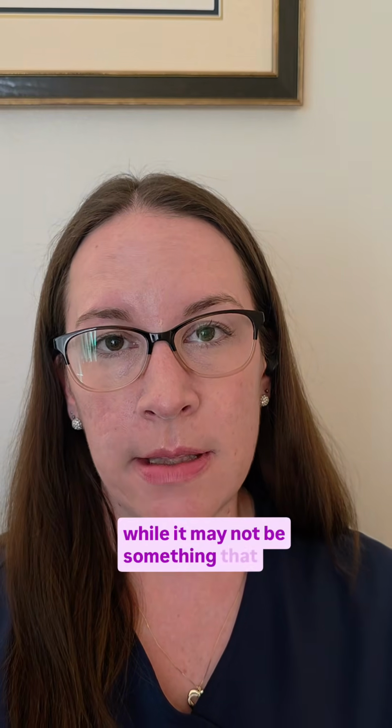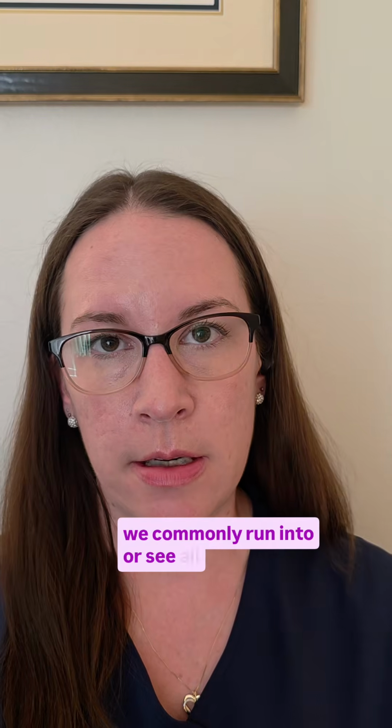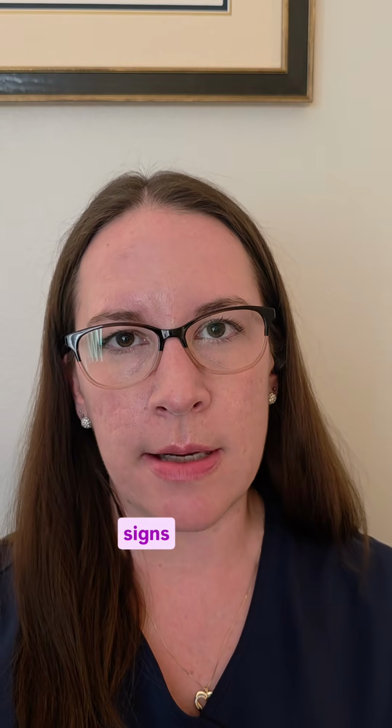So while it may not be something that we commonly run into or see all the time, there can be signs that we see during hysteroscopy. So I wanted to share that with you.